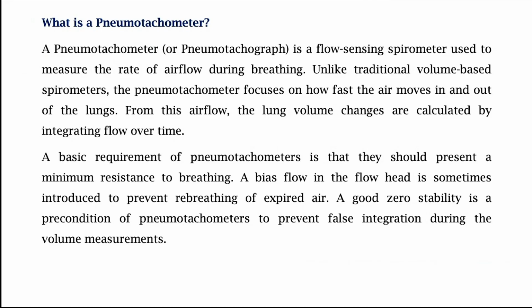And also critically remember that the pneumotachometer does not measure volume directly, but rather measures the flow, which you then have to integrate, manually or using a computer or an electronic device, because you are interested in finding the area under the curve. You need to perform mathematical integration. As soon as you say integration, remember from your high school mathematics that there is such a thing as plus C in your integrations.